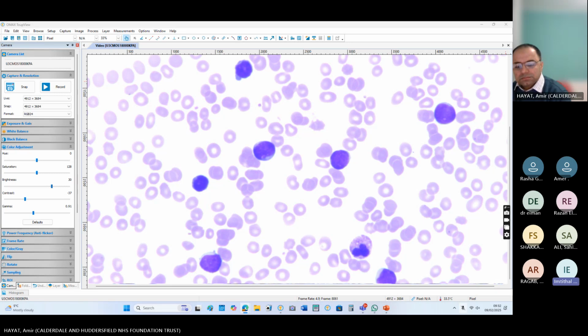I'm not sure, but maybe acute leukemia, according to morphology, maybe L1. We do not use the FAB classification anymore. Okay. So first of all, tell us about these cells. What makes you think that this is acute leukemia and it is not CLL or infectious mononucleosis?